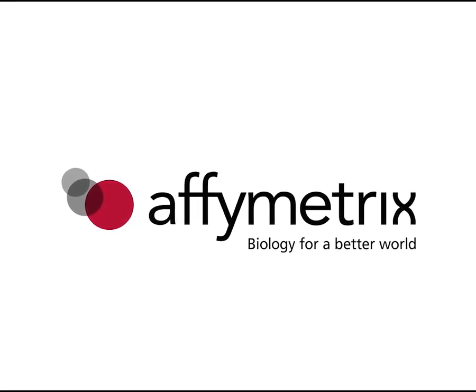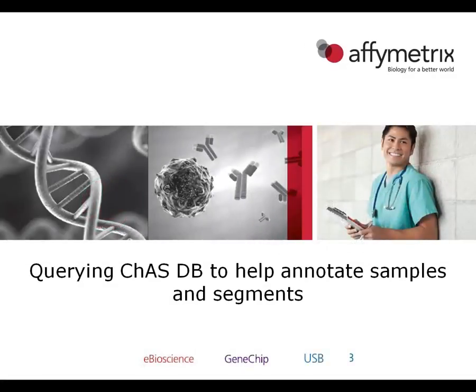In this video module, we're going to take a constitutional sample that we generated using the single sample analysis in the analysis workflow and show how we can query the ChAS database to help put annotations to the sample itself as well as individual segments.